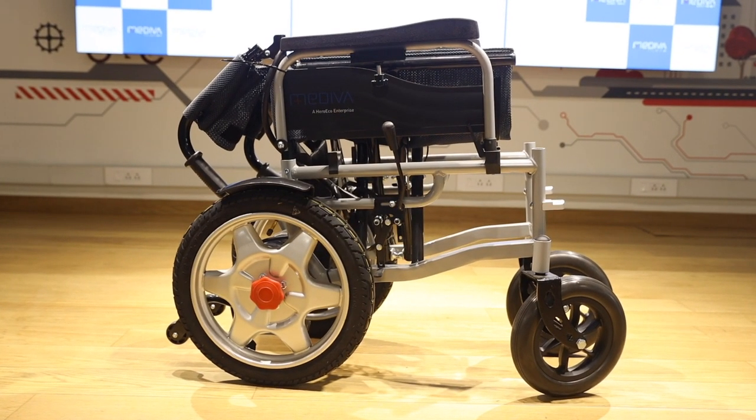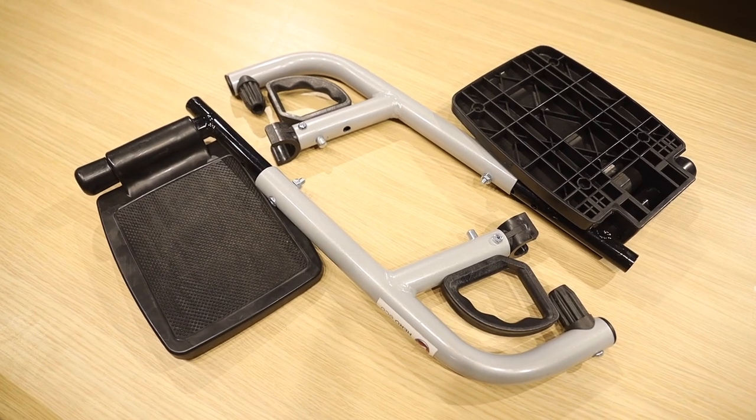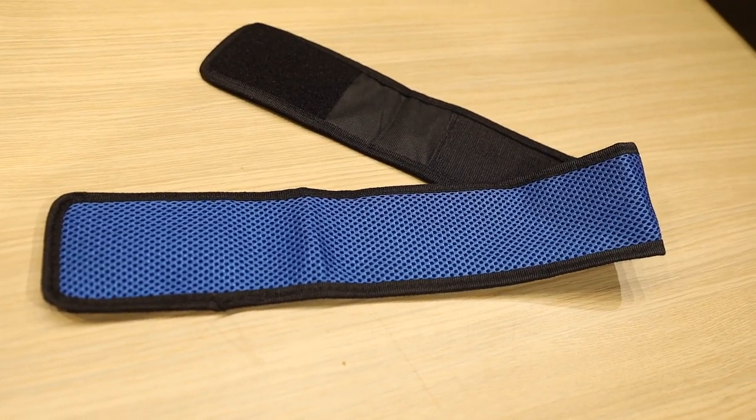This wheelchair comes with a battery, battery charger, footrest, backrest, seat and calf strap made from the finest fabric.